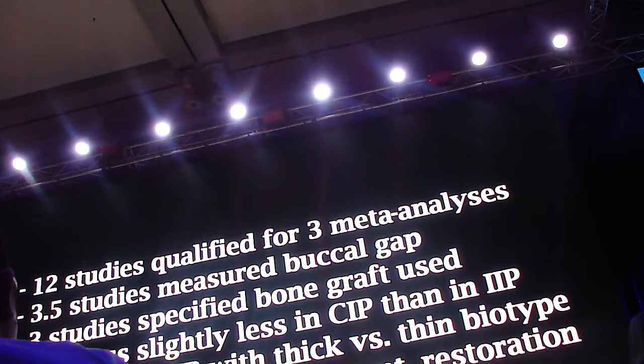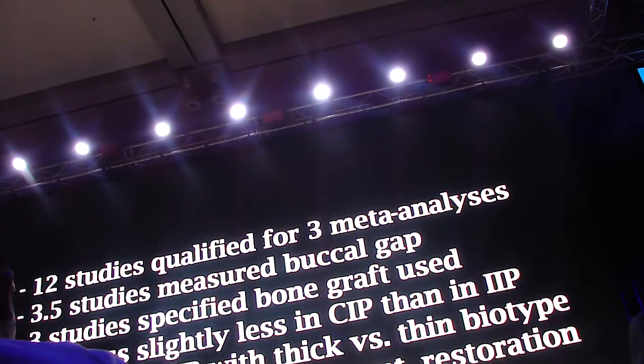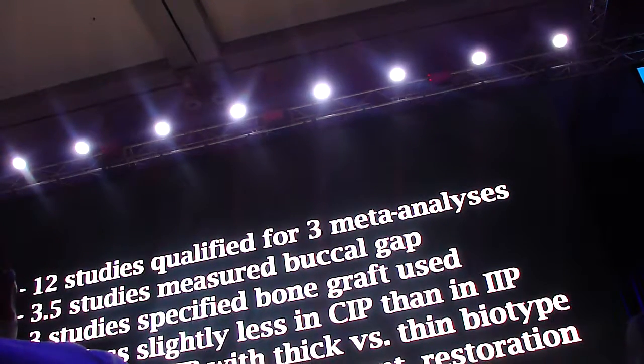was slightly less in conventional implant placement compared to immediate implant placement, so more or less the same. So you can't say you keep the buccal height better if you place an immediate implant compared to a conventional implant. They differentiated it by biotype. Well, you know, ankylos people are not so dependent on biotypes. Since we place implants deeper in the bone, we are not too much into the biotype business compared to other implant systems which you cannot place as deep.